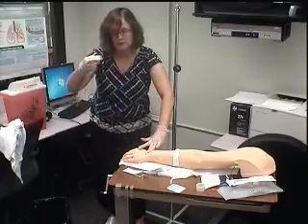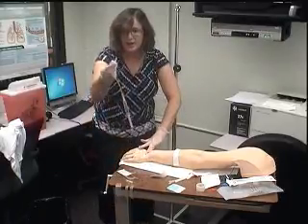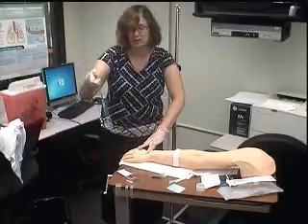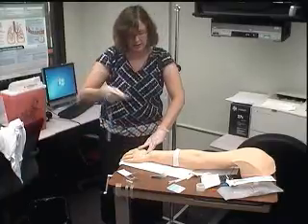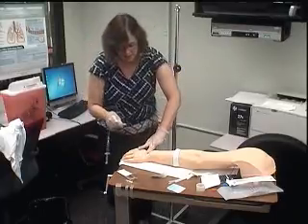Pull the needle out. And I'm just going to put it on the table, but remember that I have to throw that away. Now I've got a cap on the end of this. I'm not really good about flicking it off with one finger. Some people just flick it off with one finger. I'm not so good at that. So I come over here and I put it in here, take it off without touching any of the part that needs to be sterile.